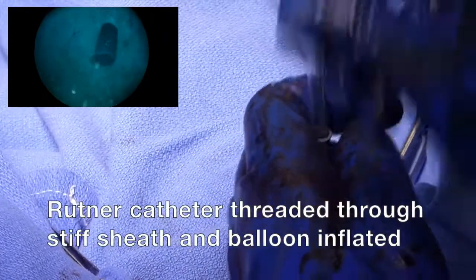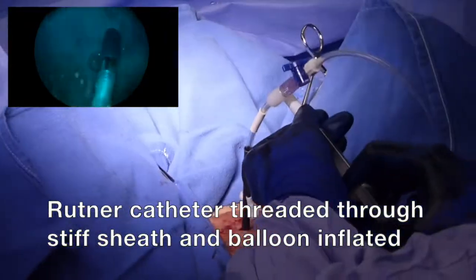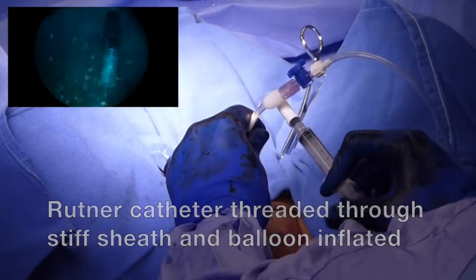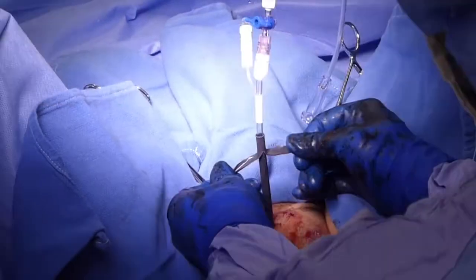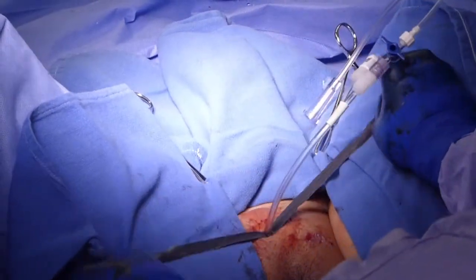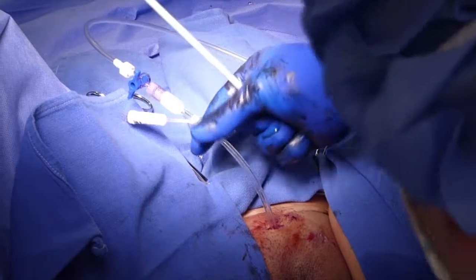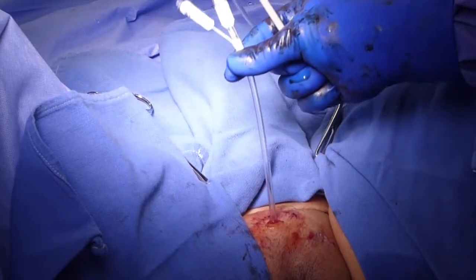Thread the Rutner into the sheath. Inflate the balloon with no more than 4 cc's. Peel apart the two ears to remove the sheath. This ends the Rutner suprapubic catheter insertion.